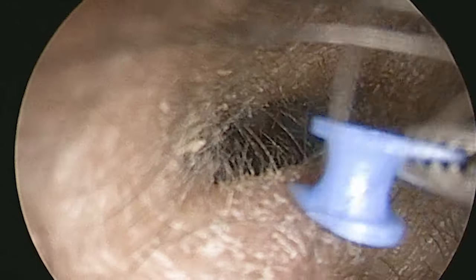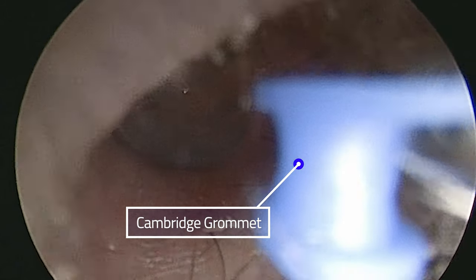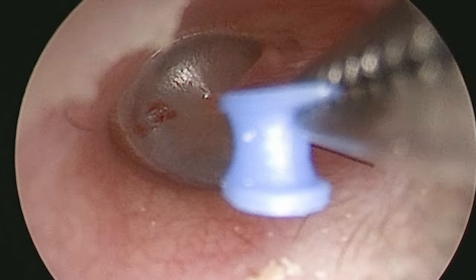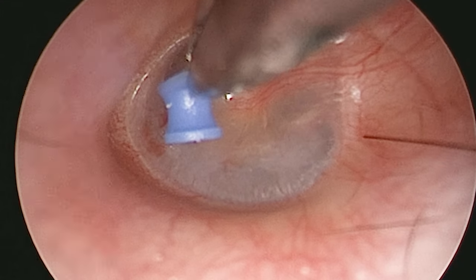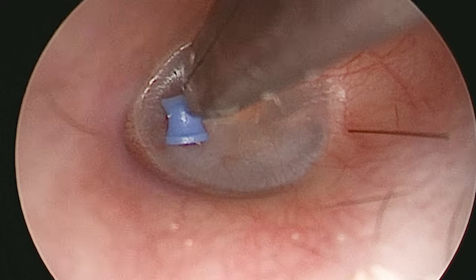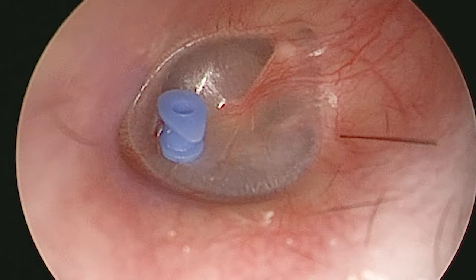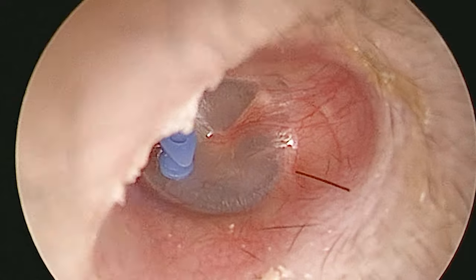The blue object coming to view now is the Cambridge grommet, which I prefer to use over a Shah's grommet because it's easy to hold with the forceps. Shah grommets seem to ping everywhere in the operating room because the nurses find it too hard to mount them properly. I put the toe of the grommet in the little hole I've made, and point it slightly down to make it easier for me to slide in with the straight needle. And that's coming into view now.